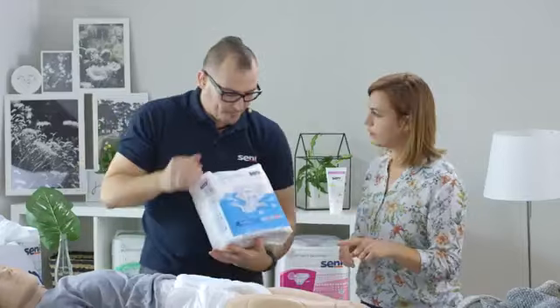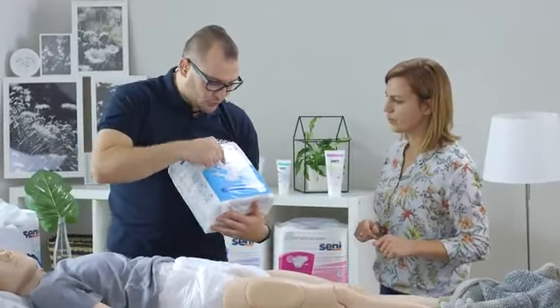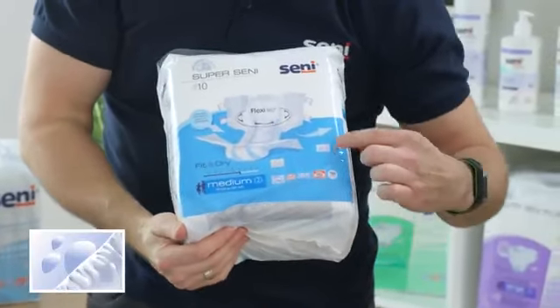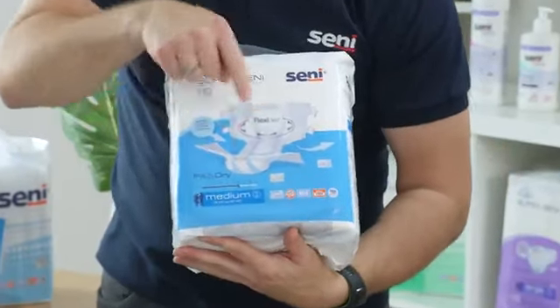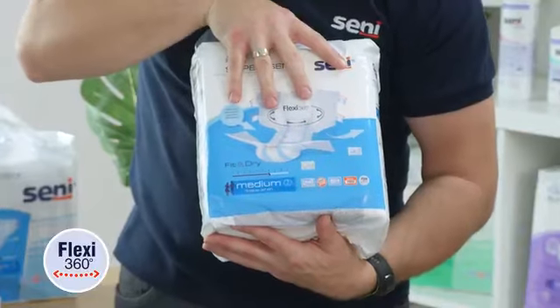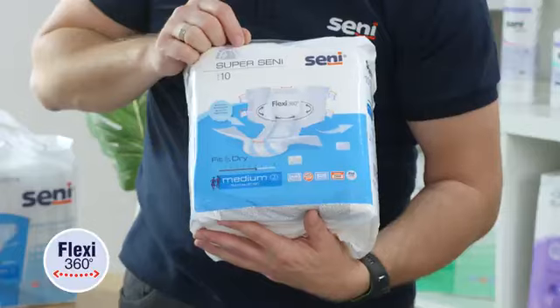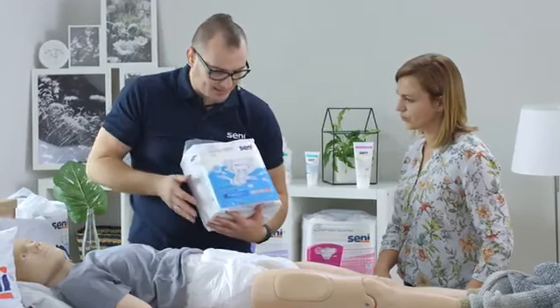Exactly. Are these all elastic elements in this product? Additional elastic elements are still inside, and there are leg cuffs, which will also be visible on this packaging. But before talking about these standing gathers, I would like to focus on this Flexi 360-degree system that I described. Here is the back of the packaging, and here it is explained very nicely. You can also look at it again at home and analyze how it works.